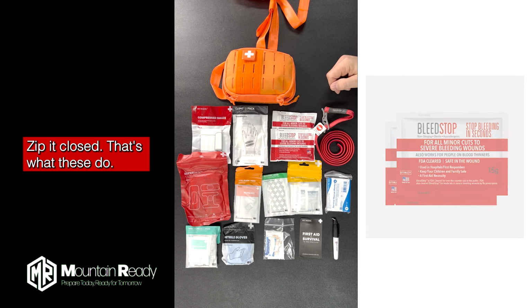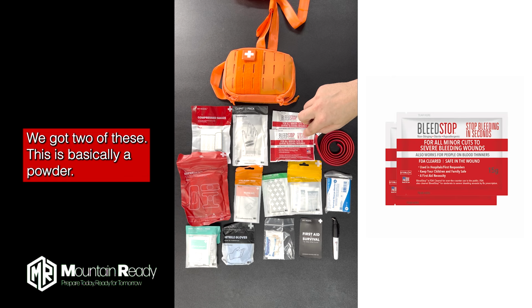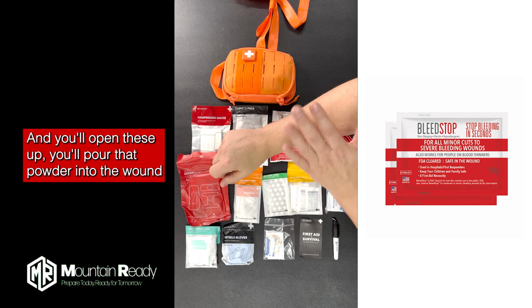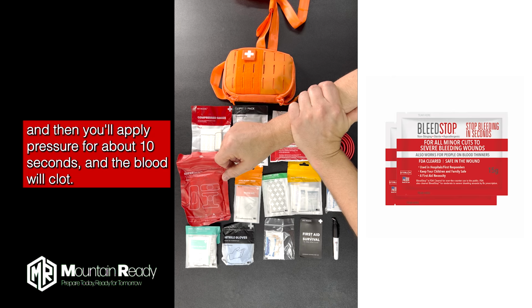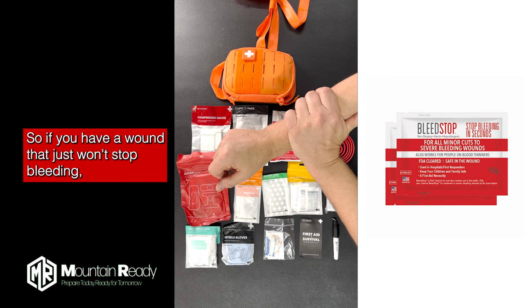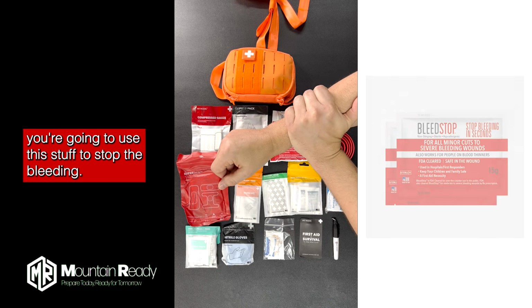That's what these do. These are Bleedstop packages. We got 2 of these. This is basically a powder, and you'll open these up, you'll pour that powder into the wound, and then you'll apply pressure for about 10 seconds, and the blood will clot, okay? So if you have a wound that just won't stop bleeding, you're going to use this stuff to stop the bleeding.